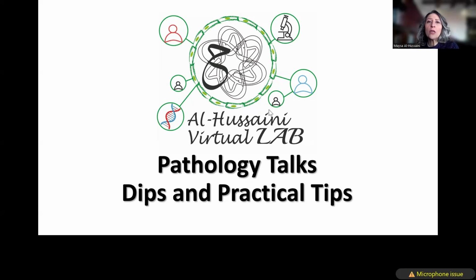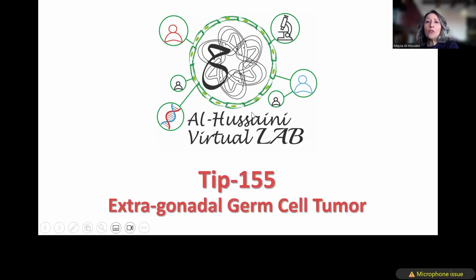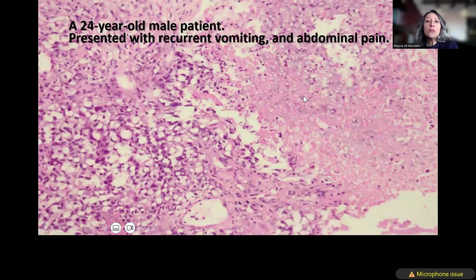What I'm going to be sharing with you is a nice example of a rare occurrence and an important pitfall. This is a case of an extra-gonadal germ cell tumor occurring in the duodenum. This is a 24-year-old male patient who presented with vomiting and abdominal pain, and on radiological examination was found to have a duodenal mass. The mass was biopsied, and this is the low power magnification of the biopsy.